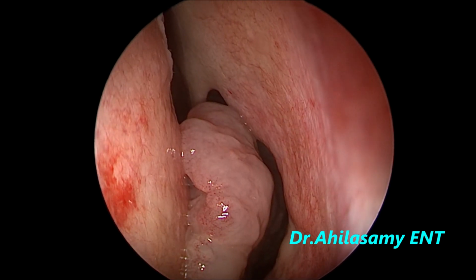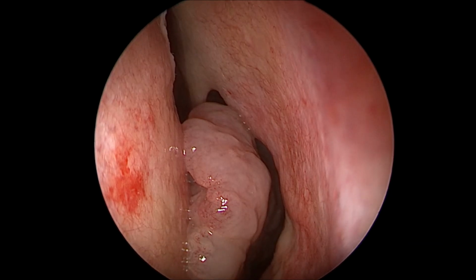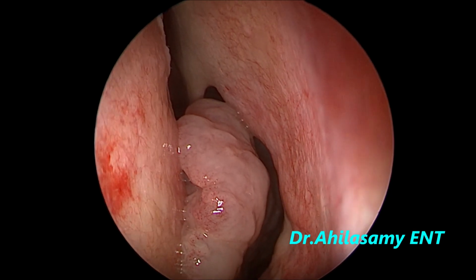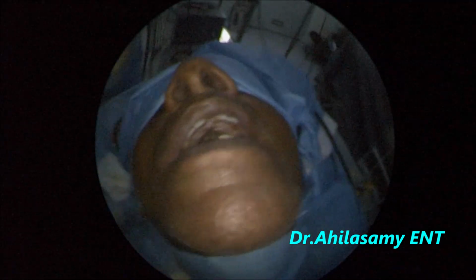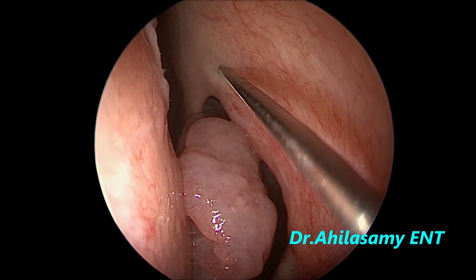After decongestion, the mass has shrunk not much, but you can see the polypoidal mass. I don't know the attachment. Of course, if you had taken a CT scan, then you would have known the attachment.